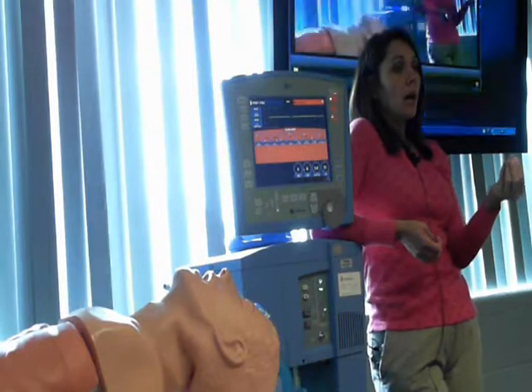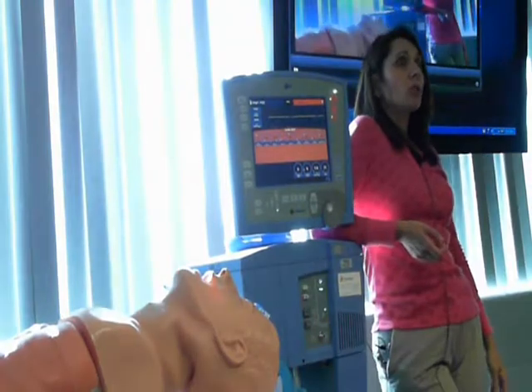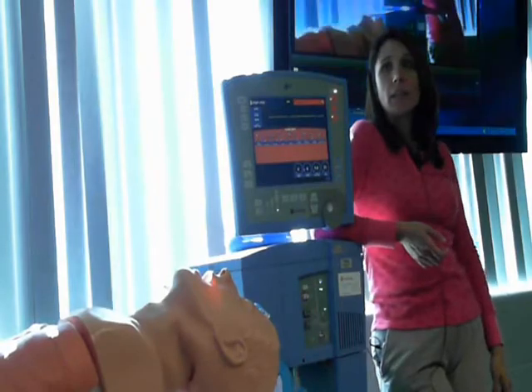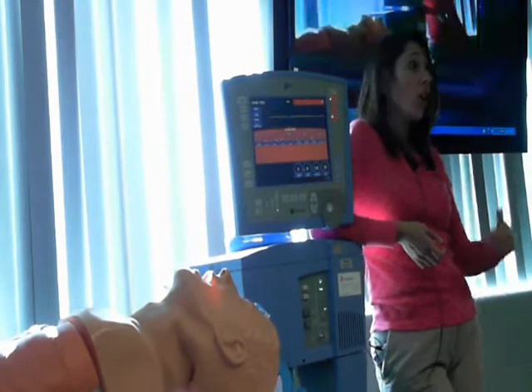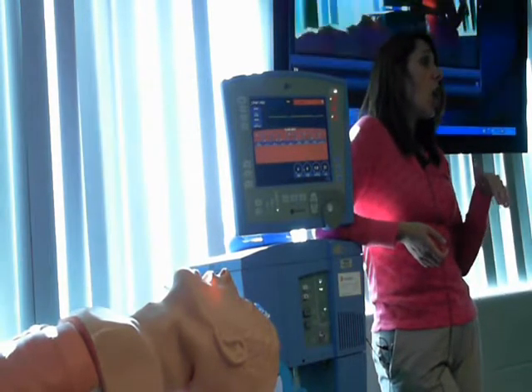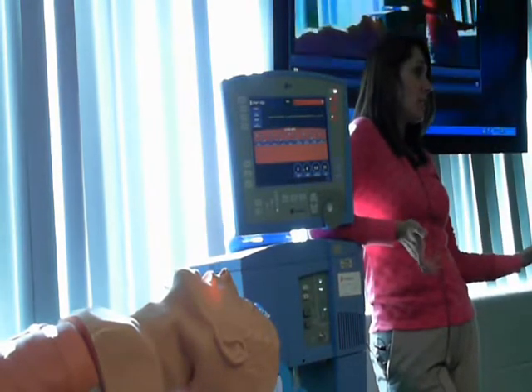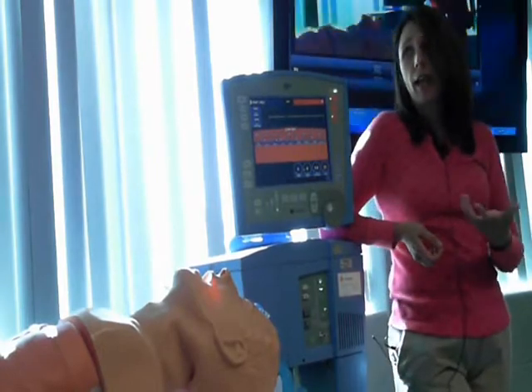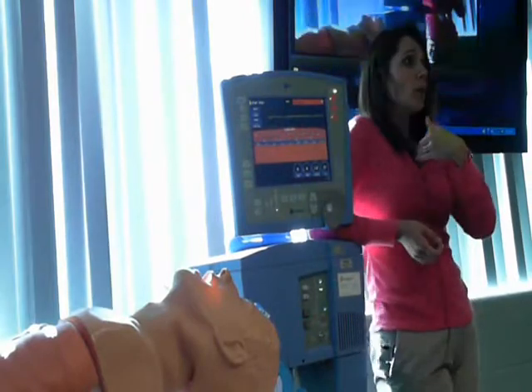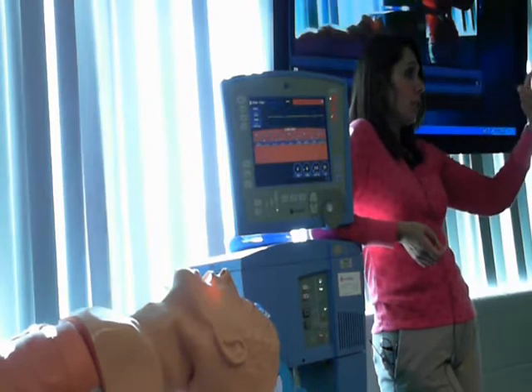Let's say, for example, a very healthy individual goes in, they have a very unfortunate trauma, they have to have some surgery, they get out of the OR at 10 o'clock at night and they've had heavy sedation. Oftentimes, we will maintain them on mechanical ventilation on a critical care unit overnight to give the sedation from the OR time to leave the system. In that case, the patient doesn't have any pulmonary issues, and so we could turn the vent down to a spontaneously breathing mode and see if they will pick up their minute ventilation.